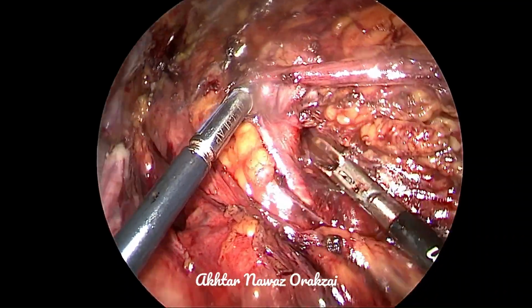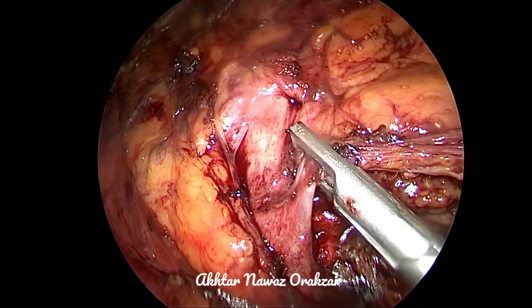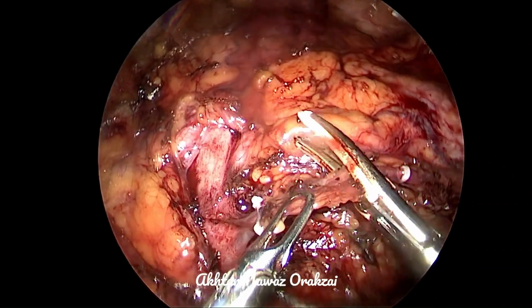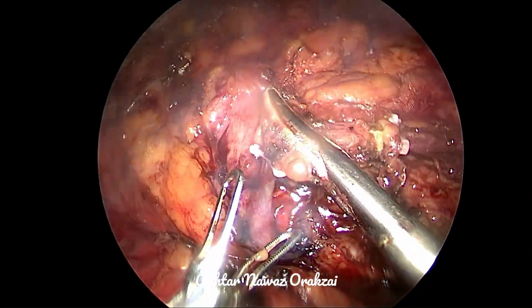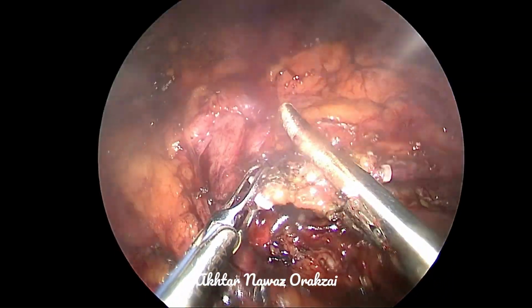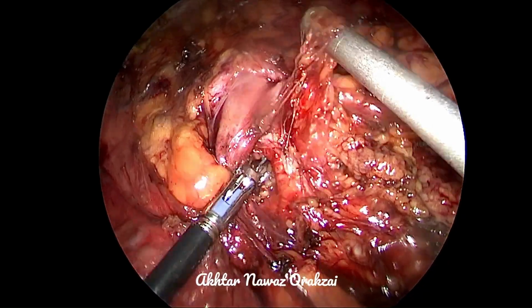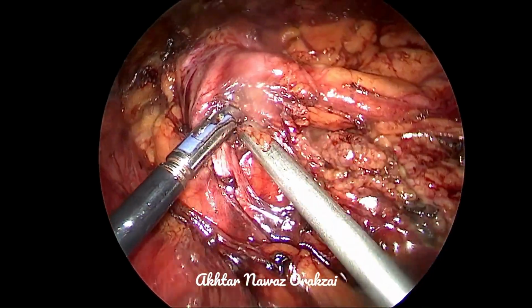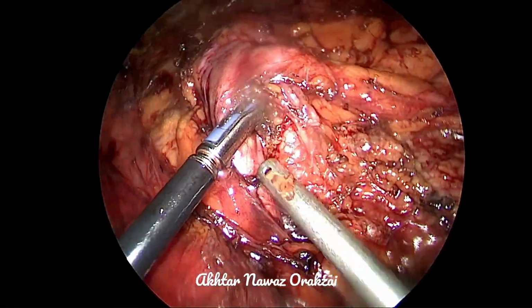However, with passage of time and experience, one can appreciate various tissues: vascular, venous and arterial tissues. You can differentiate between the fat and the lymphatic tissues. However, if you already have it in your mind that dissecting medial to the gonadal vein may bring you to the surface of the aorta, then the chances of injuries are very slim.